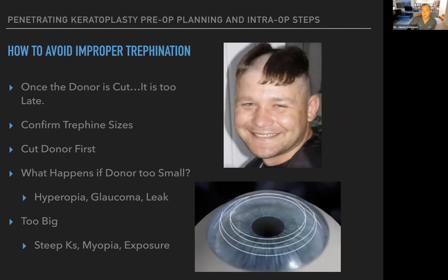How to avoid improper trephination. Like this picture, you can only cut your hair, you know, one time. Once you've cut it, you can't grow it back, or you can, it takes time. So once the donor is cut, it's too late.